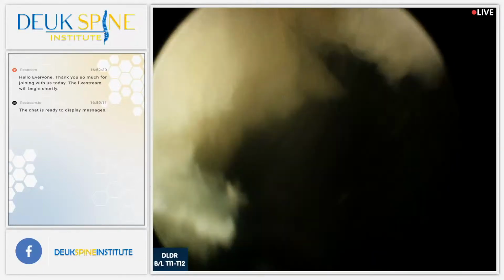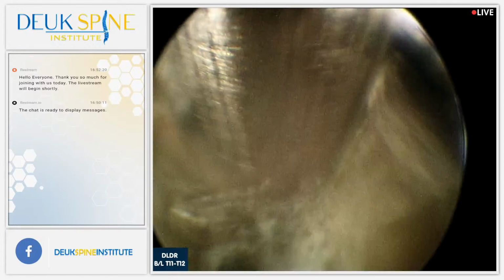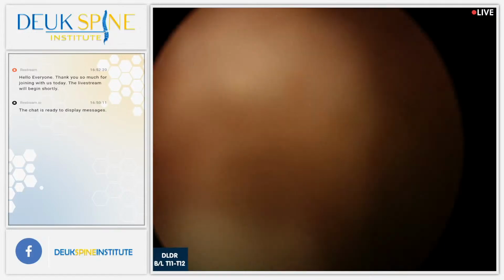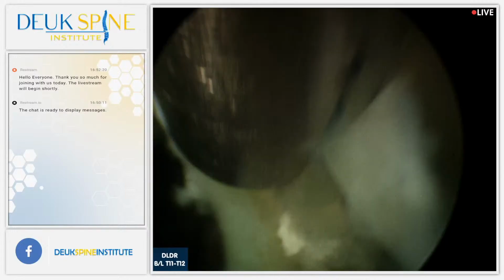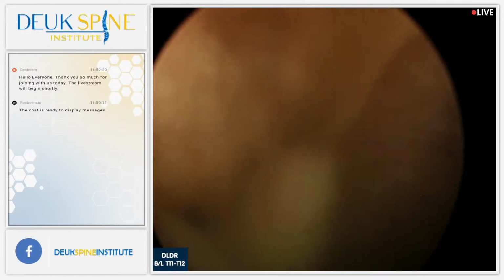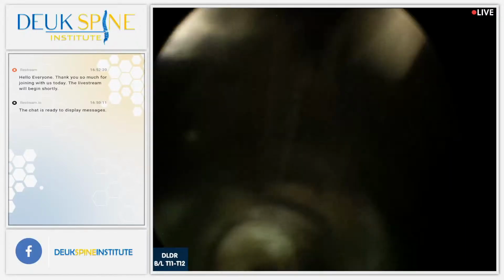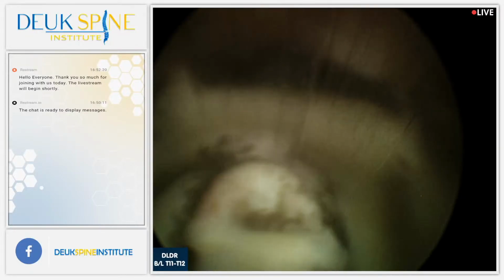There's another piece of herniation, and it's really hard herniation. In other words, it's really thick, callousy. We call it a callus. Callus is just scar tissue, right? Isn't that right, Davis? Yes, callus is scar tissue, and that's what she has. But instead of this callus being where there's a fractured bone, well, there is a fractured bone, but this is a callus in the disc, basically. You can see all the pieces of herniation right there.